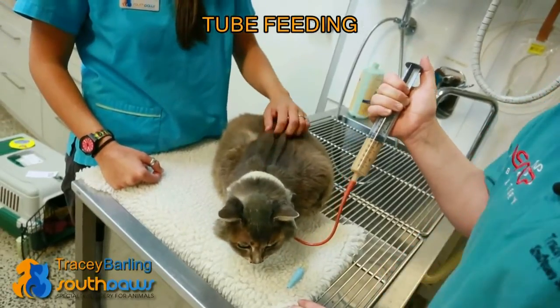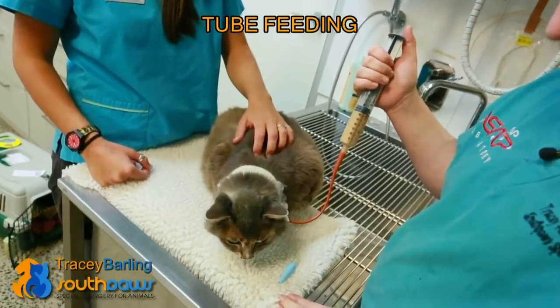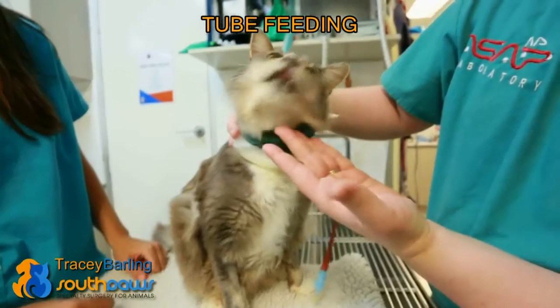If the patient hasn't been eating for a while, it's best not to just give them the full amount — it's too much for them to take. If they get too much too quickly they can vomit, and then that can cause other problems like aspiration pneumonia and things like that.